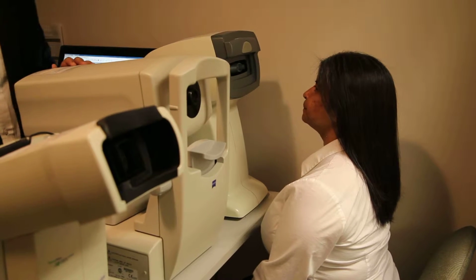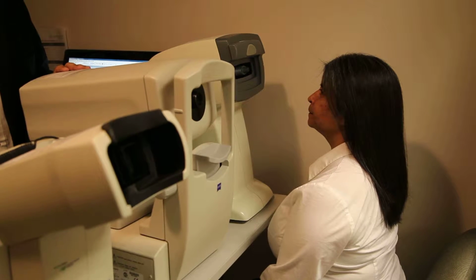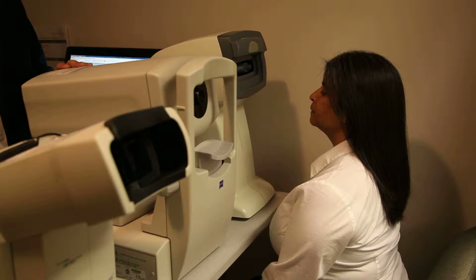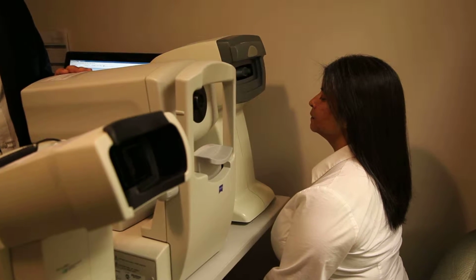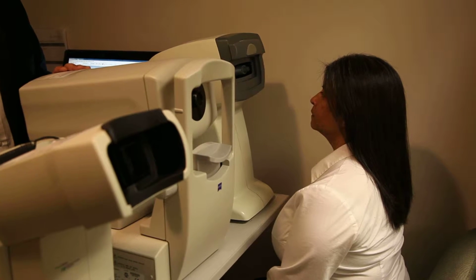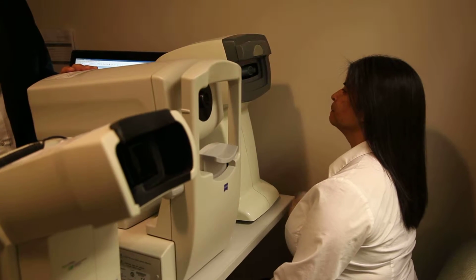So one thing I did forget to mention earlier is you want to check to see whether or not the patient agreed to do the digital retinal imaging or the Optomap. Now, if it's a new patient or if it's a patient that hasn't been here in a while, they will most likely have filled out a HIPAA form at the front desk. On that HIPAA form, they will have indicated whether or not they'd like to do the optional digital retinal imaging.